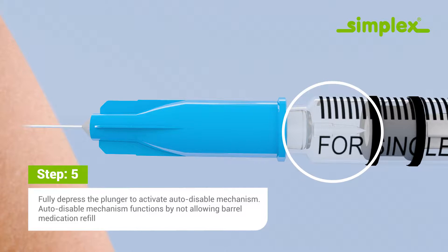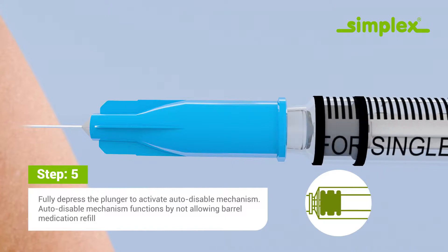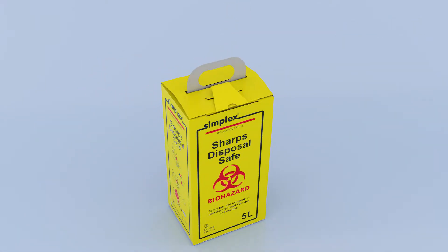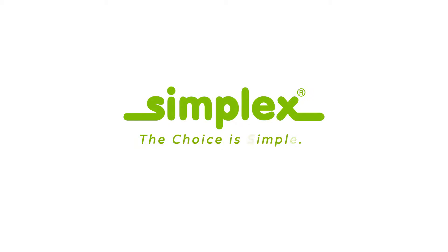The auto-disable mechanism functions by not allowing barrel medication refill. Dispose of the syringe in a sharps container. Simplex — the choice is simple.